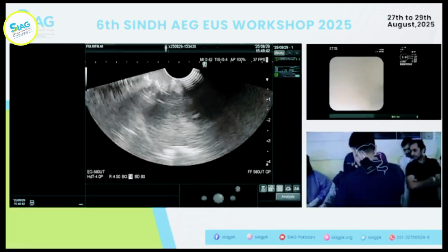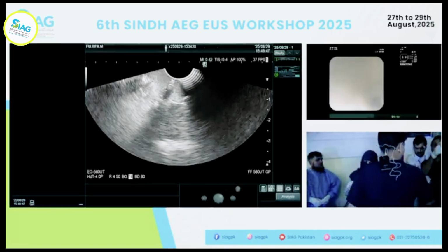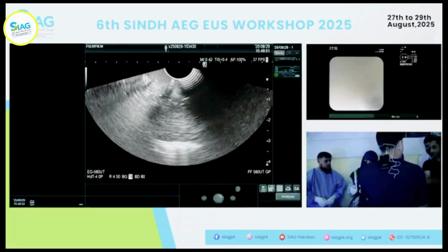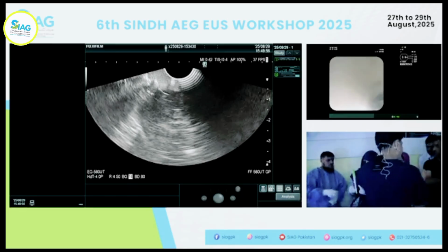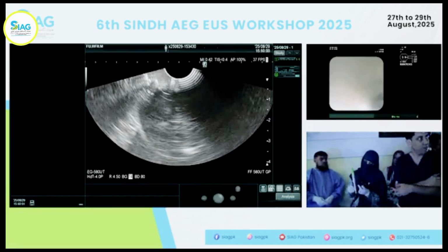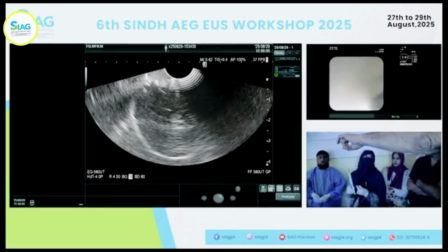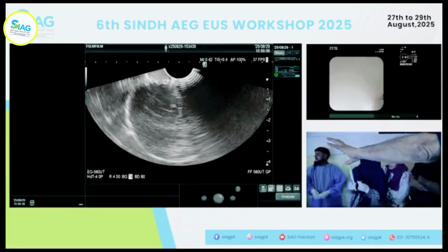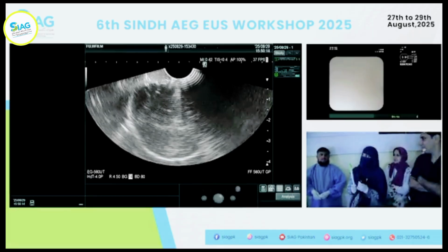If you look at the sheet, if you've got too much out, it's going to push the mucosa away from you. Okay, you need to take it out enough so you don't cause any damage to the scope. But if too much of the sheet is out, it's going to push the mucosa away from you. Okay, and that's why you say, I'm just. Yeah. Hanji. Exactly. That's why I think if you're not sure, and let's say this is a model, but it gives you very nicely. You can see the sheath there. You don't want to press the mucosa with that sheath, like Dr. Nadeem said. You want to pull it back just enough that it's coming out of the scope.